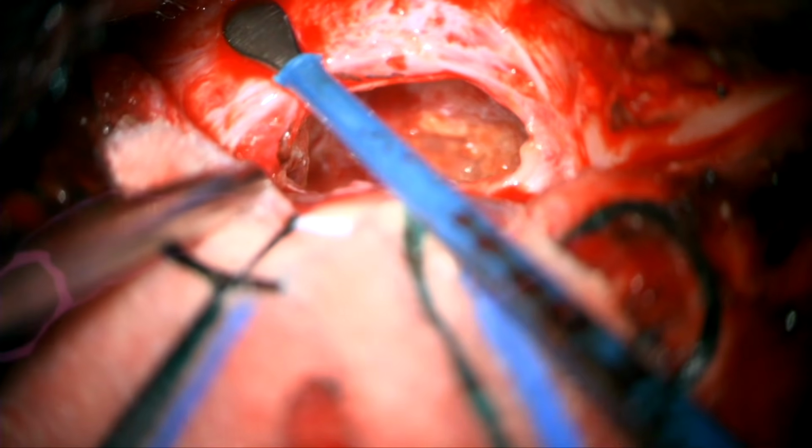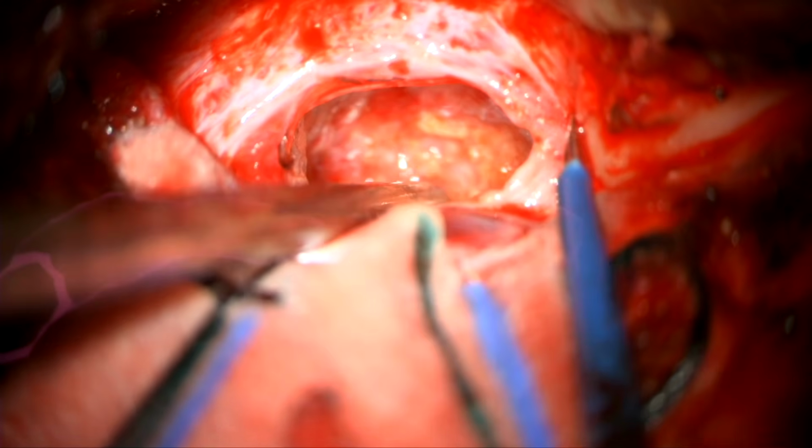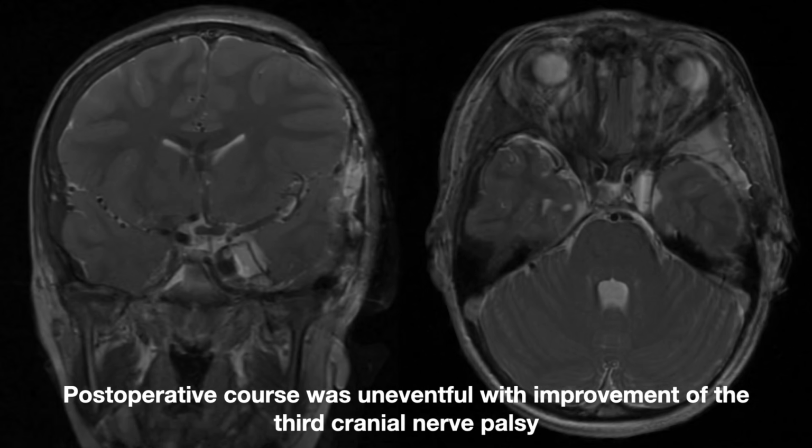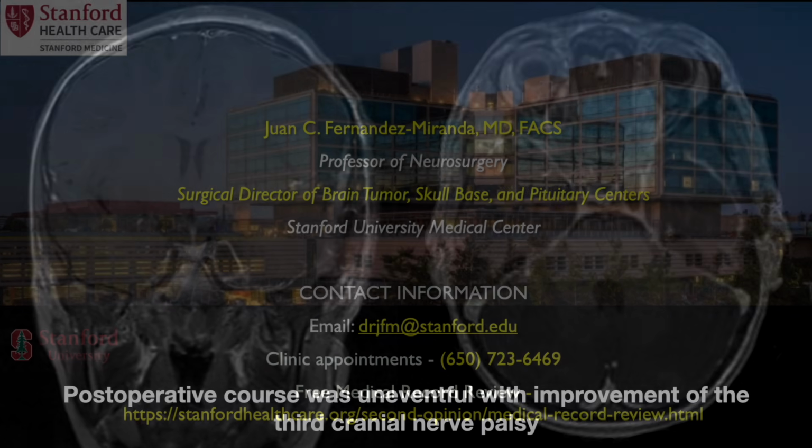We stimulate the nerves at the end of surgery. We get V3 down inferiorly and 3 superiorly. Patient had an excellent outcome with recovery of the third nerve palsy.